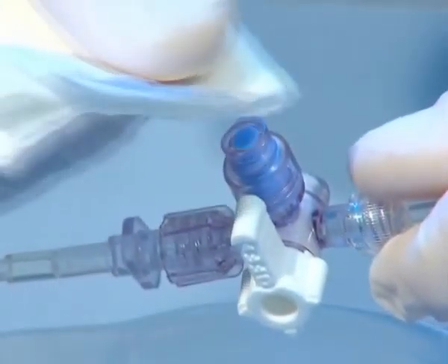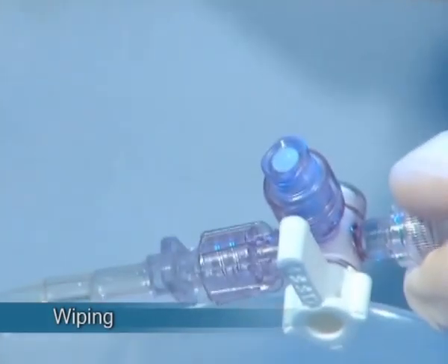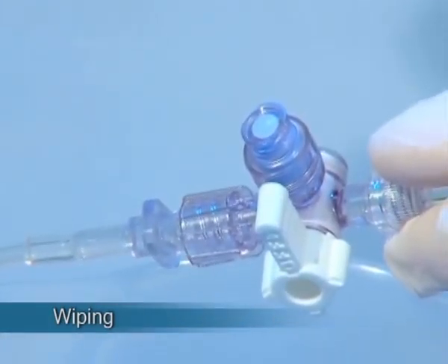Blood sampling through the Marvelous is almost identical to standard stopcocks with lure activated valves and is divided into four stages. The first stage is wiping the closed port according to institute policy.